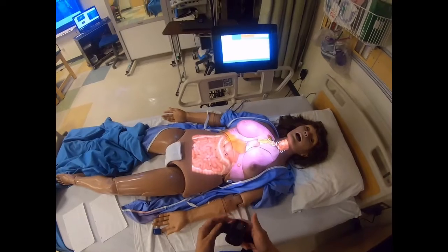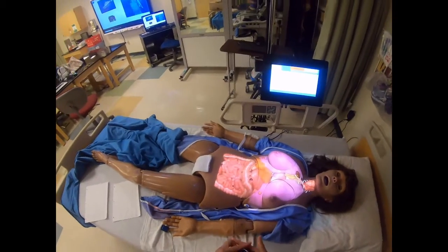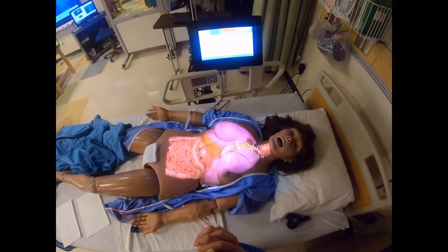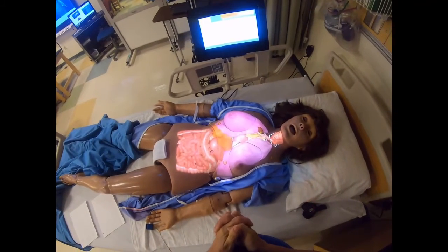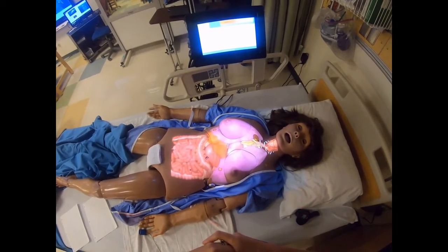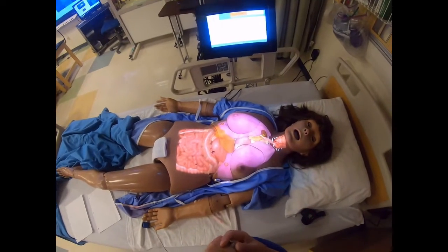Another way that we may see false readings are patients who have been involved in a house fire or have been exposed to smoke. Carbon monoxide is bound much more readily to hemoglobin than oxygen. We call that an affinity. So the hemoglobin has a greater affinity for carbon monoxide than it does for oxygen.